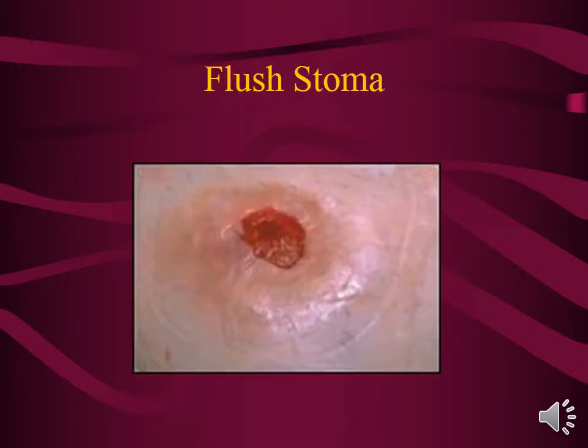This is a flush stoma. Surgeons used to make all stomas flush because we thought we needed to irrigate everything, but we have learned that the only thing that we should irrigate is the sigmoid colostomy.